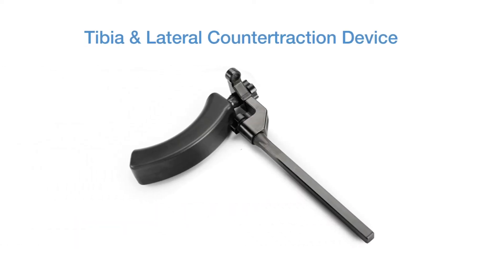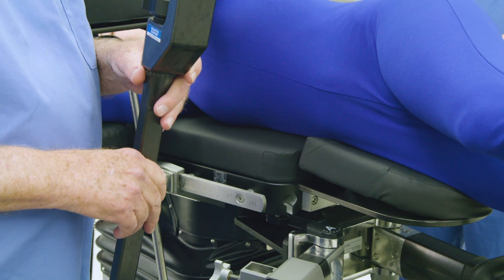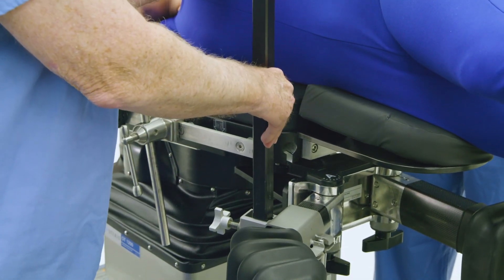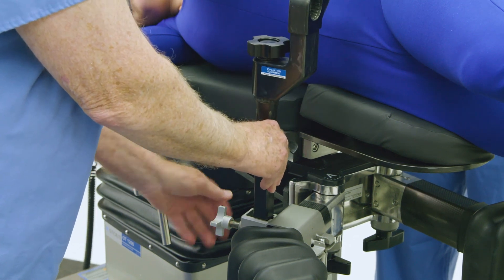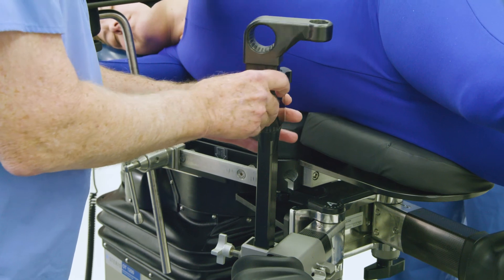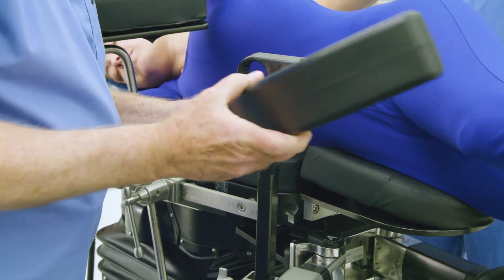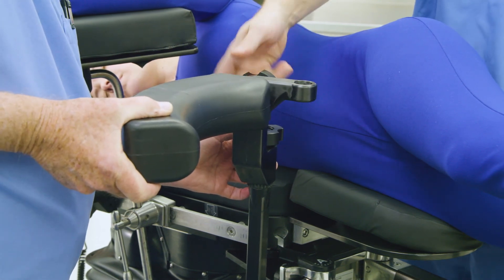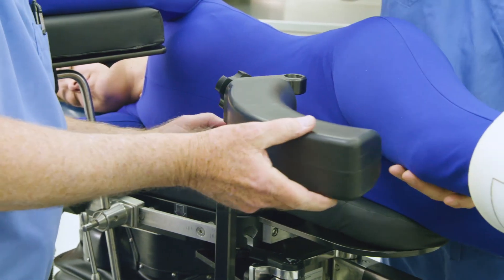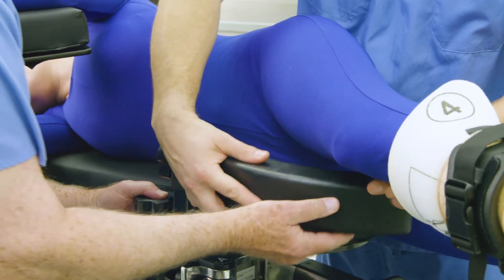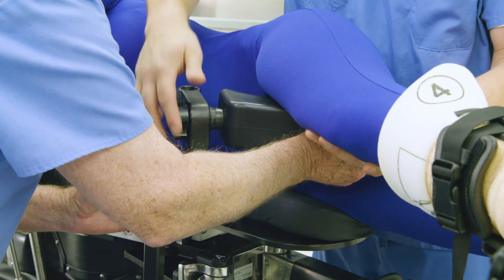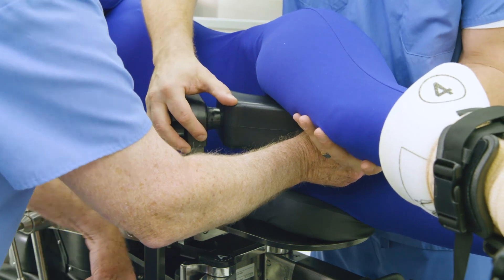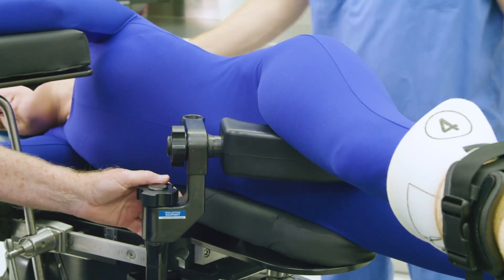In preparation to pull traction when the patient is in a lateral position, the tibia and lateral counter traction device must be installed. Insert the long shaft of the tibia lateral counter traction support into the accessory spar clamp on the non-operative spar. Position the counter traction support to the height of the patient's perineum and tighten. While supporting the patient's affected leg, rotate the tibia lateral counter traction support between the patient's legs. Adjust the height to compensate for patient size and ensure the patient is snug against it, then tighten the knobs to secure.